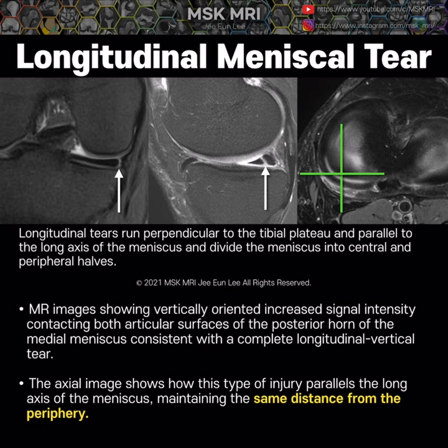This axial image shows how this type of tear parallels the long axis of the meniscus, maintaining the same distance from the periphery. This type of tear should not extend to the free edge.